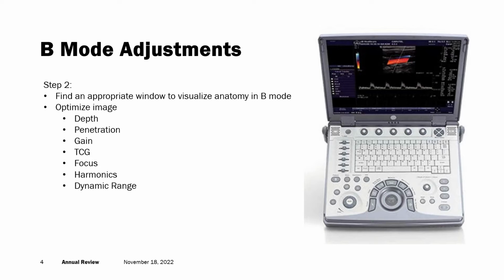Another thing that we use as sonographers all the time is suspended inspiration typically. So having the patient breathe in and hold their breath often pushes anatomy out from under either ribs or bowel gas or different things. So don't be afraid to have them do that if that's possible.